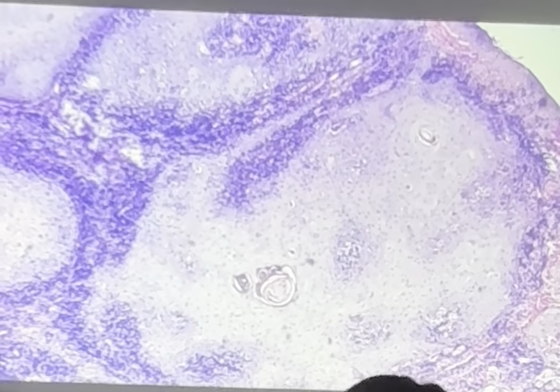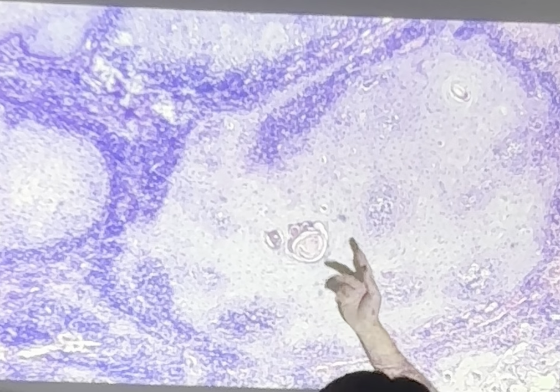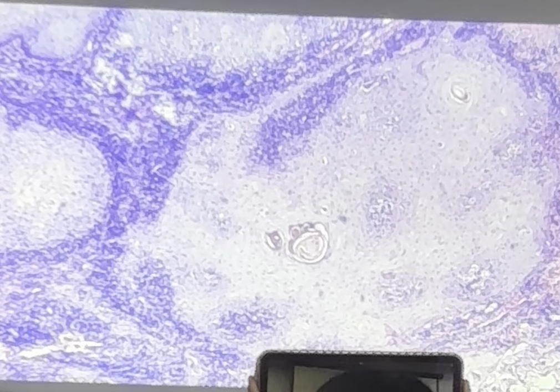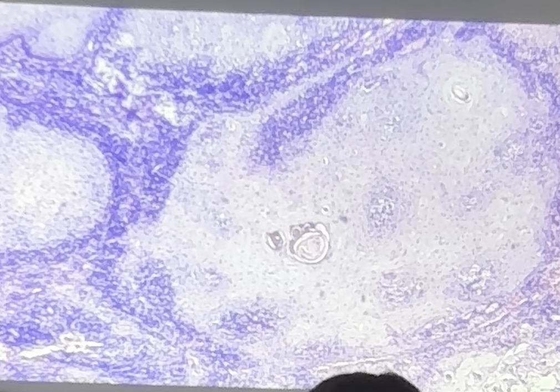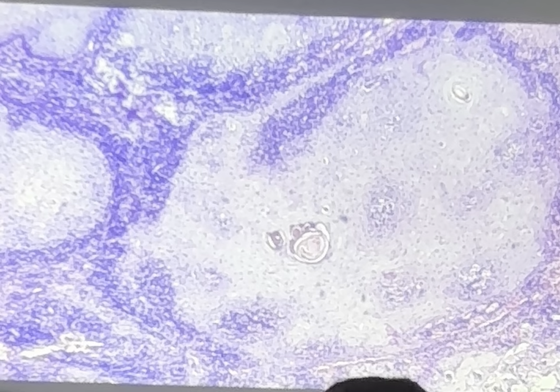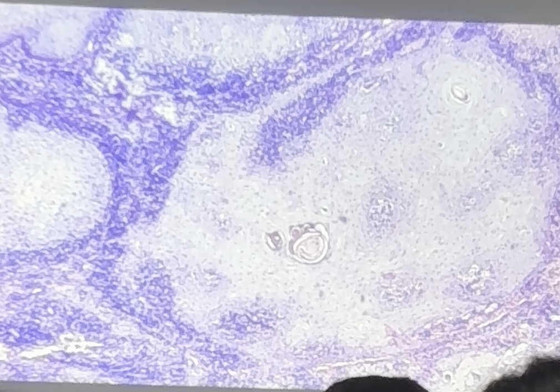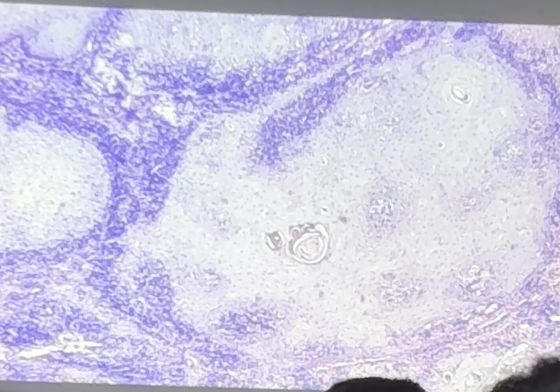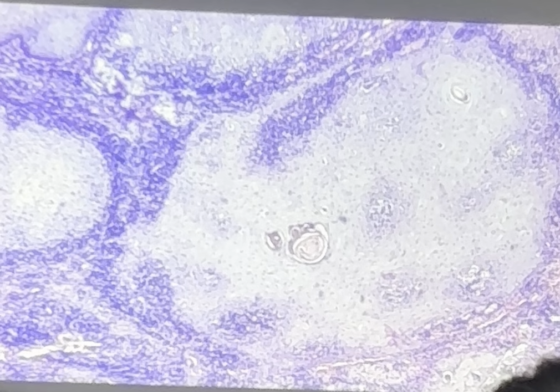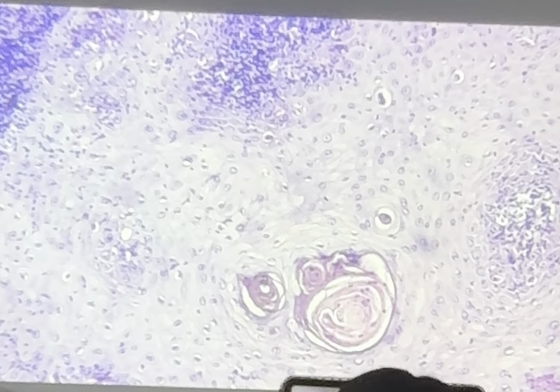And if we look at these cells, we even see a very unique structure here. So you do need to know that structure. That structure is called a keratin pearl. Because what cells produce keratin? Squamous cells. So this is a squamous cell carcinoma, because it's a tumor of malignant squamous cells. If you see keratin pearls, that tells you that the tumor came from squamous cells. Because the treatment of squamous carcinoma is different from that of adenocarcinoma. So you need to know the difference.